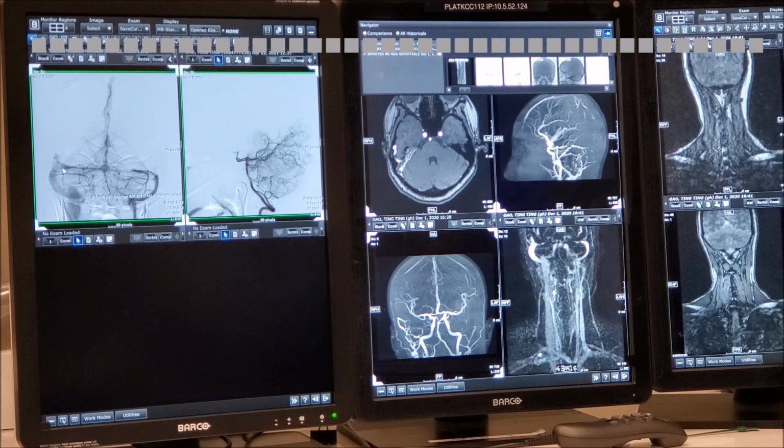And the washout can come from where? From the other suppliers of the region, like the right vert branches, posterior meningeal, a little higher up. We're going to see when we do the carotid injection how the brain drains. It's not infrequent that one side is dominant to the other. So it could be the dural fistula, of course. Could be thrombosis, but could be dilution.